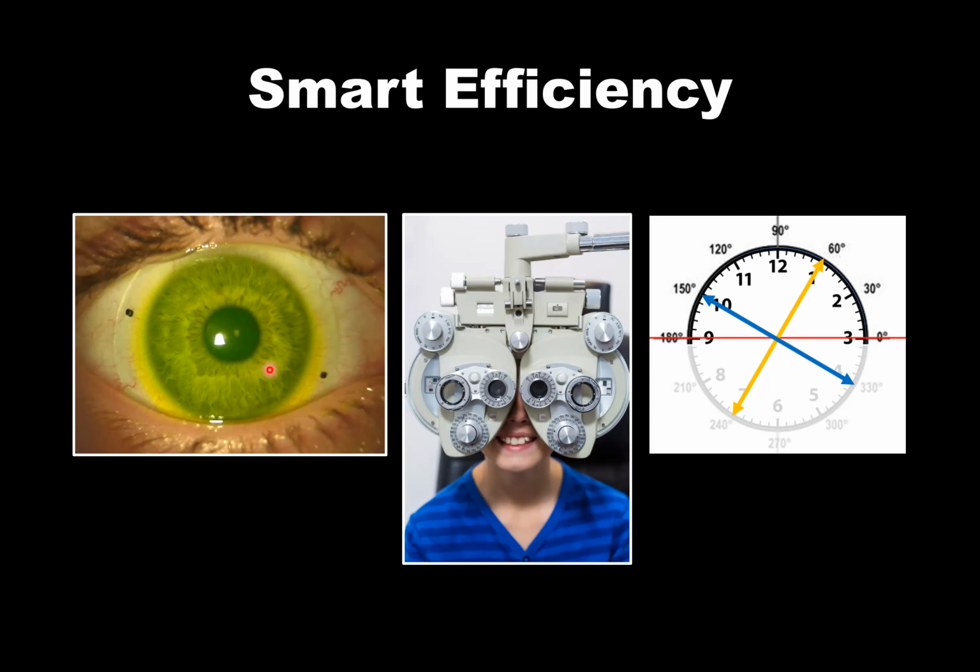This creates great efficiency in practice because I don't have to pull another diagnostic lens out of the set. I don't have to order a different diagnostic lens from the distributor to place on eye to determine if I can create rotational stability. I know that from my 15.5 and 16.5 diagnostic lenses.